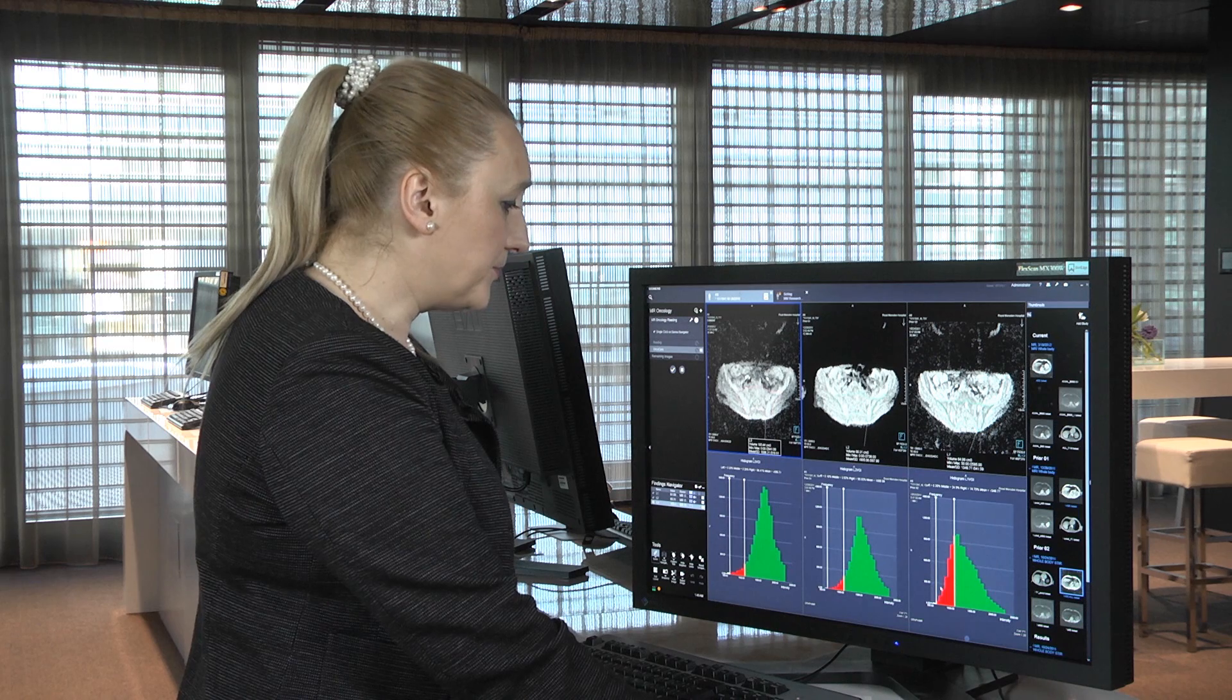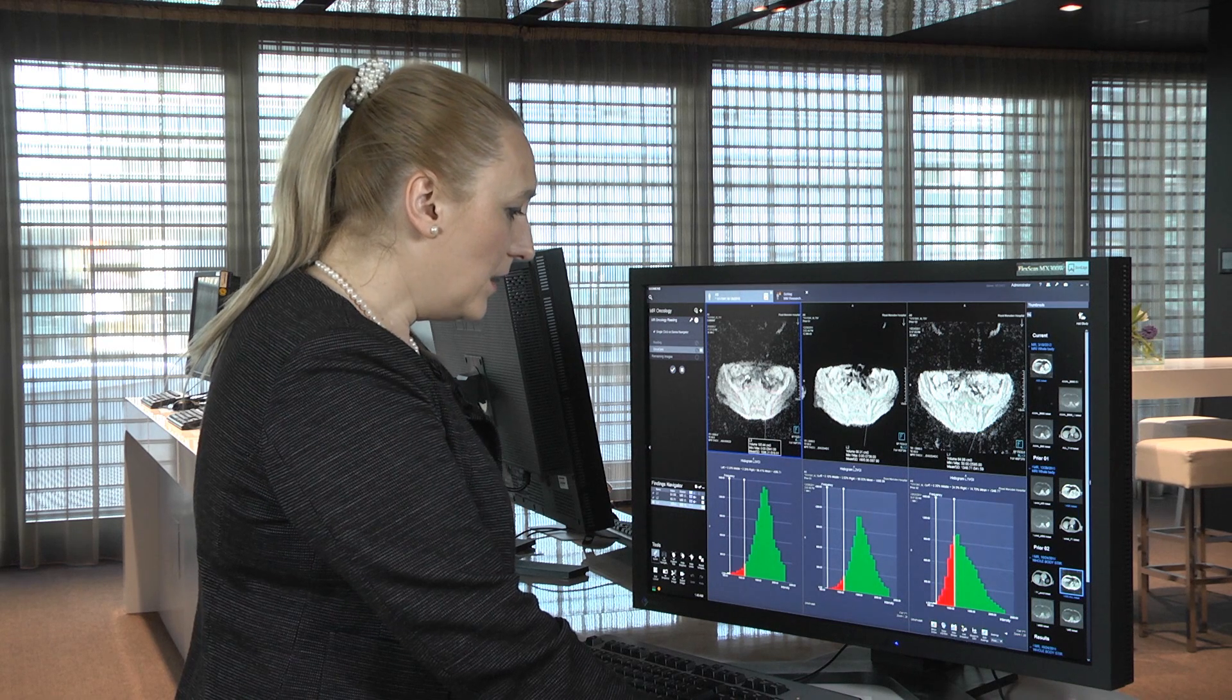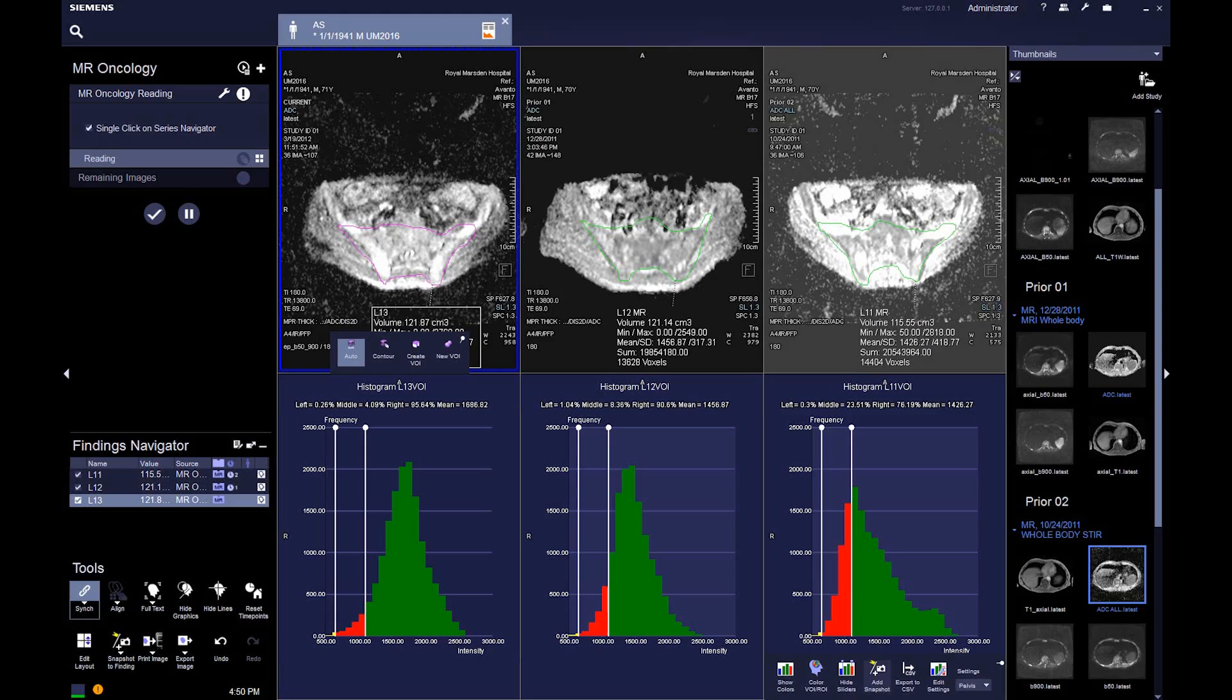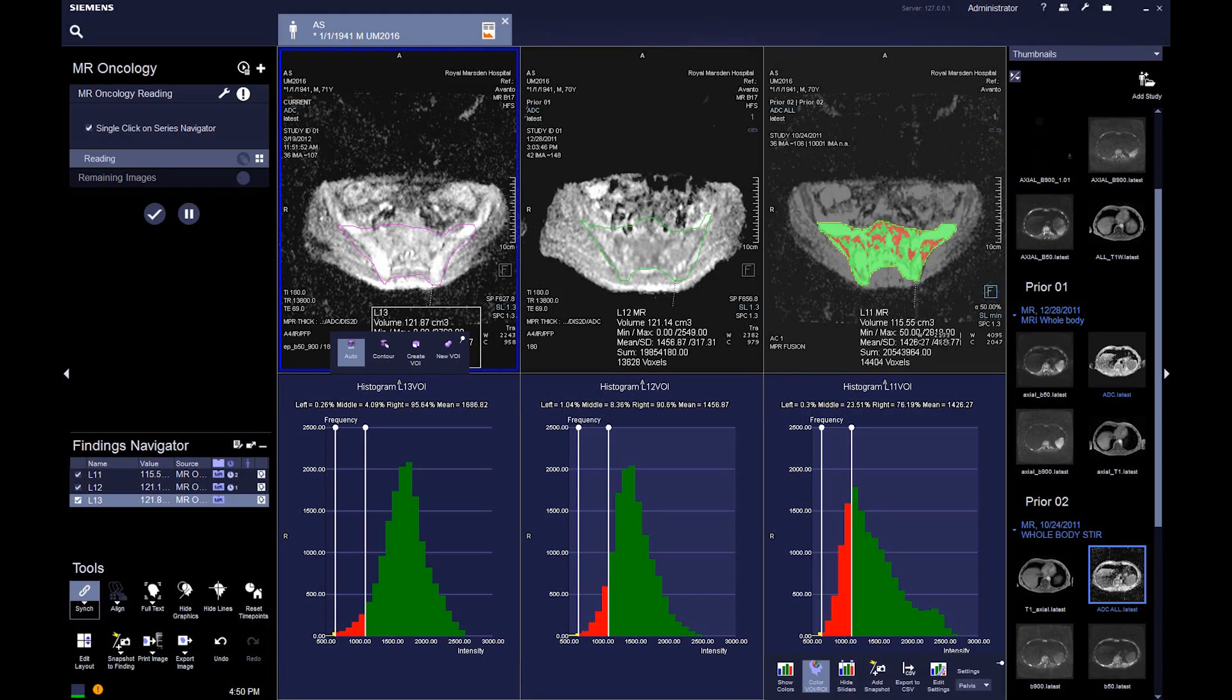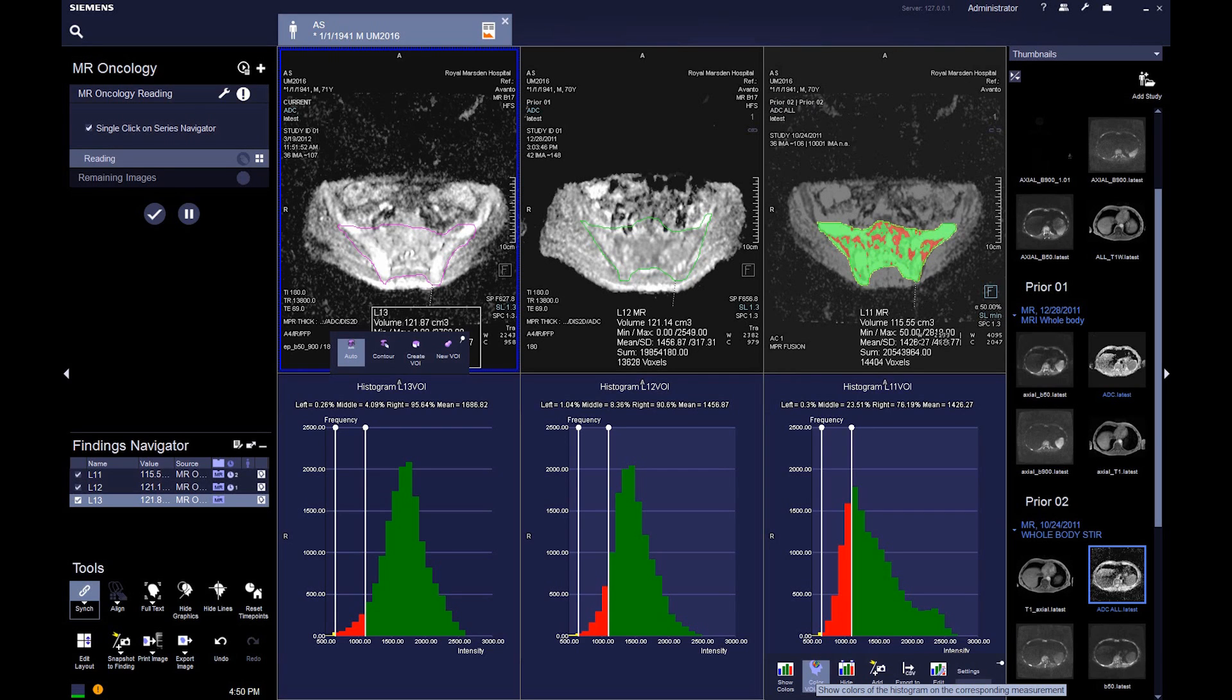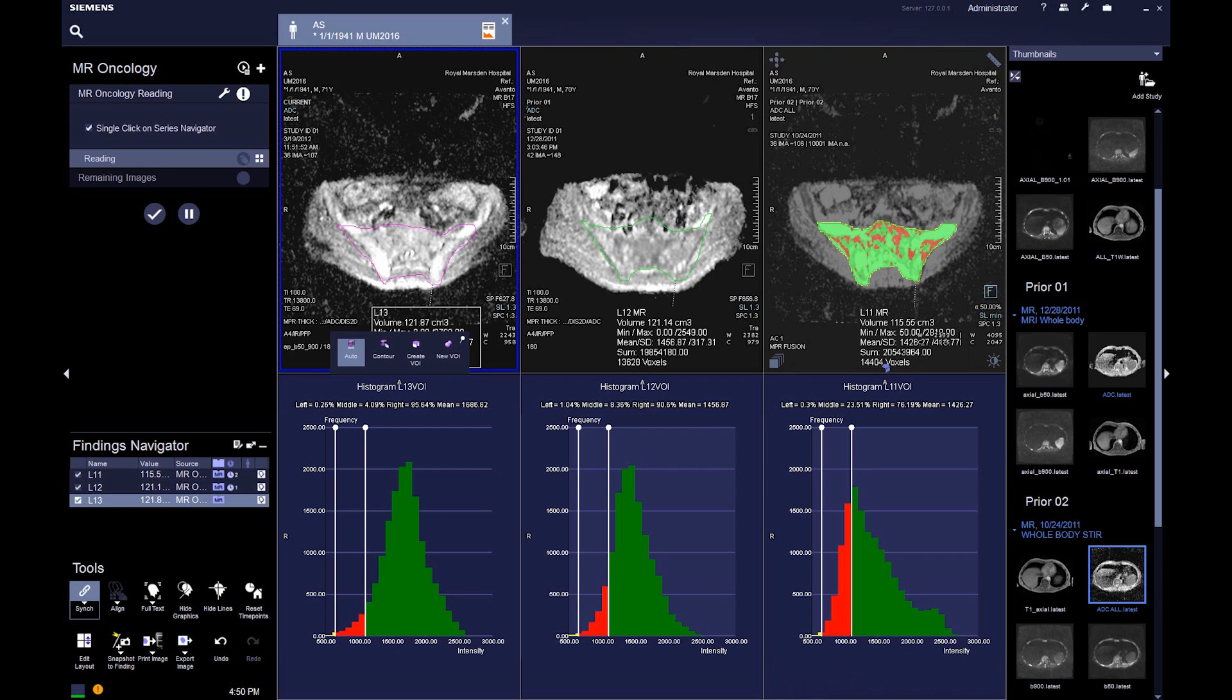If we are going to back map the colors, the pixels with red are the pixels in which the tumor has a high cellularity. The pixels with green are the pixels in which the tumor has an ADC above 1200.